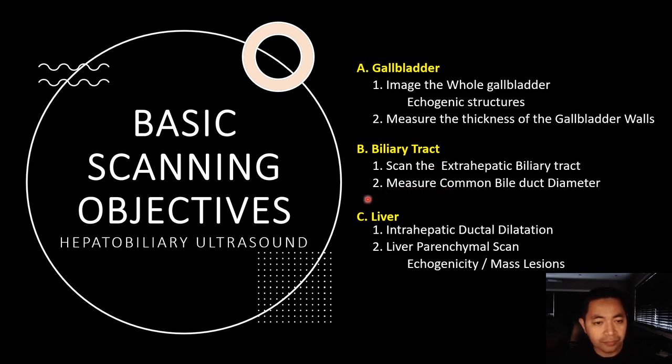accurately. Third, the liver must be visualized well also, taking note of any intrahepatic ductal dilatation or mass lesions. The overall liver echogenicity should also be taken note of.